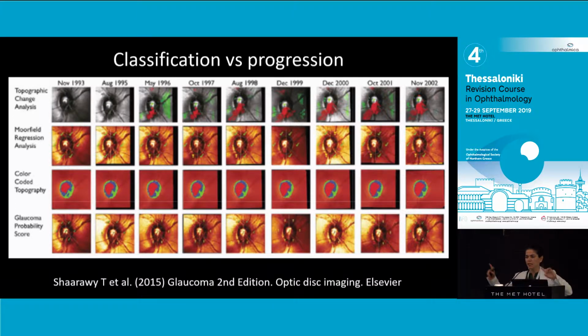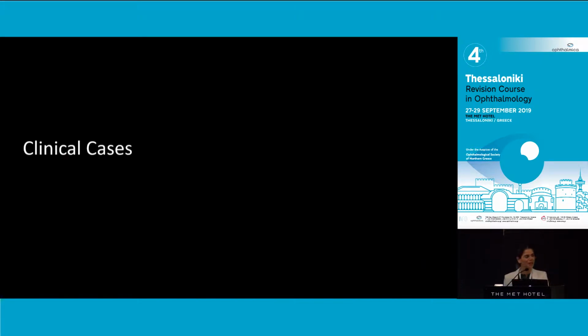People sometimes think that it's the other way around, that I will do my imaging at baseline and then follow my patient with a visual field. Of course you need the visual field, but imaging is more useful for monitoring the patient, not for diagnosing the patient.